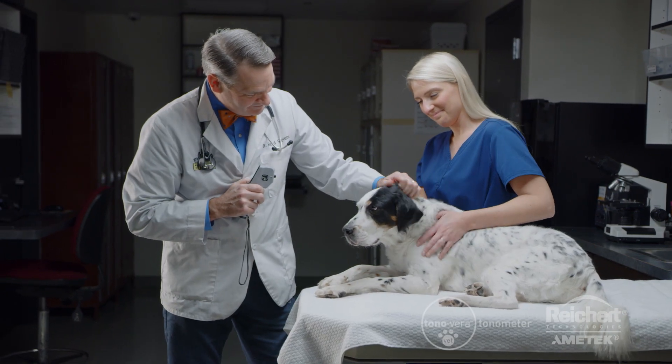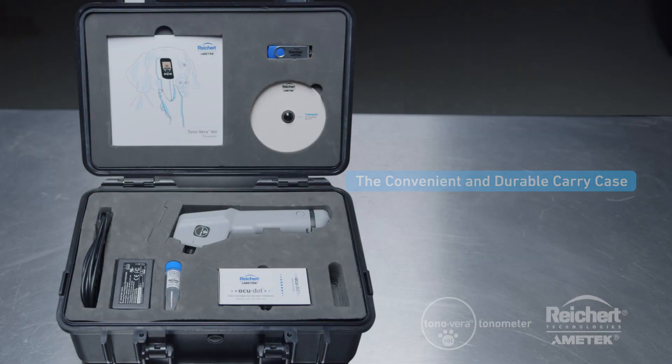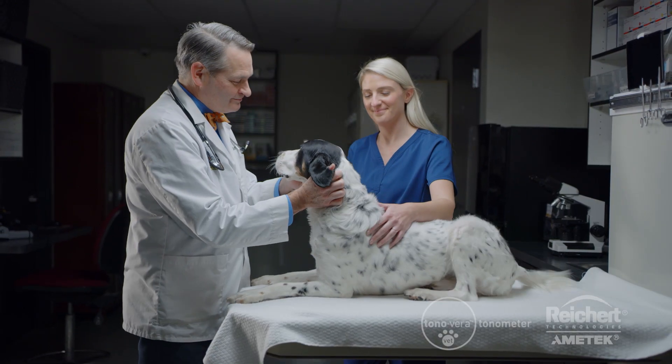Easily and safely store all the items you need for a mobile exam in the convenient, durable Tanavera Vet carry case. The carry case stores AccuDot tonometer probes, charging cords, training aid, and a USB containing the quick start guide and instructions for use.